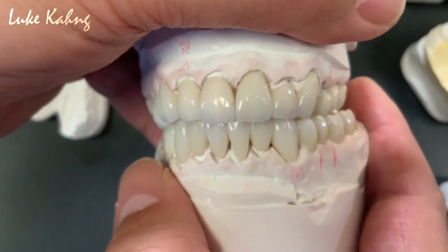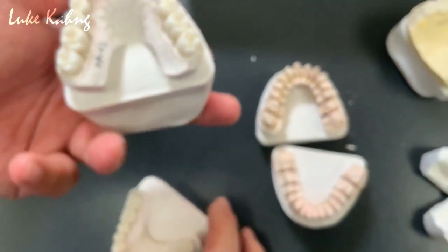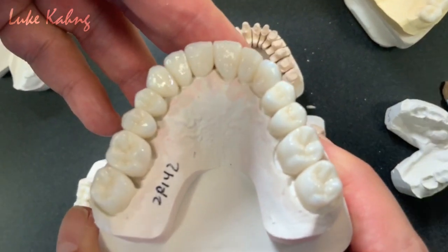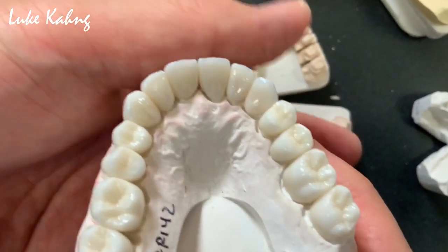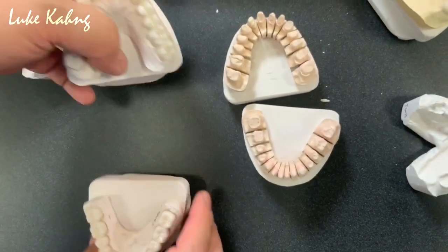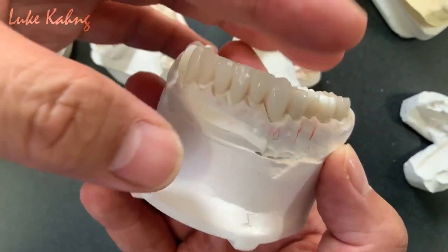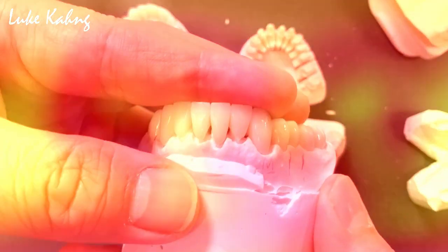I like the buccal corridor. Other side. Anyway, this one. Okay. Individual looking, it's good. Good linear contour. All right, and then here too. Okay, so we're building very nicely. All right, thank you.